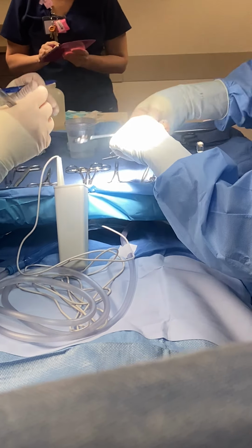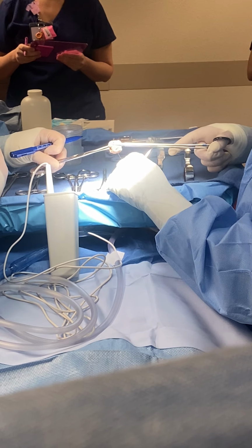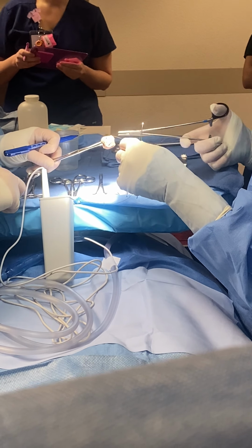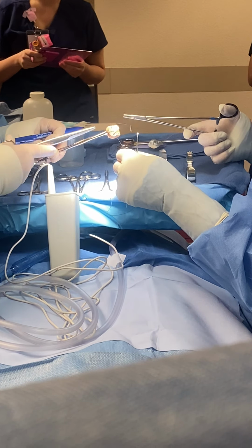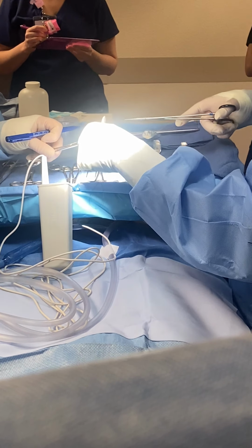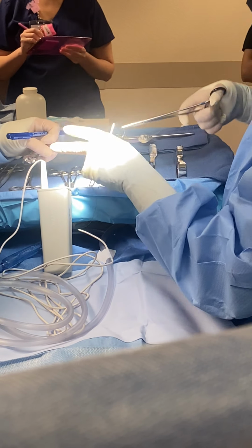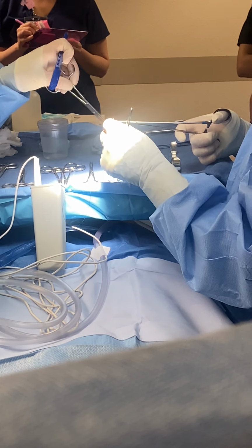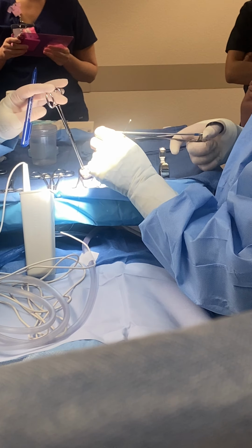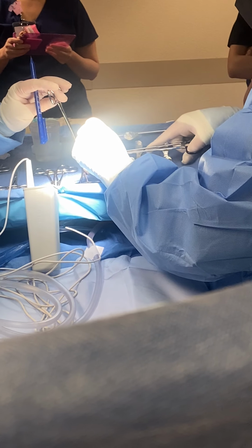Could you help me out? Yes. I was getting the DeBakey to see if I could just hold the specimen itself. Where do you want? Yeah, okay. Good. Thank you. All right, and we'll put a short stitch. Superior. Yes.